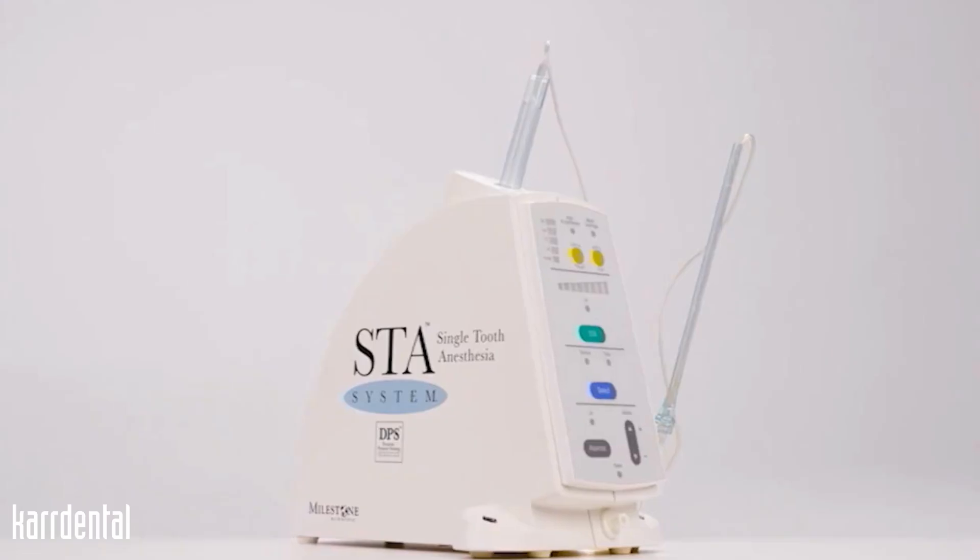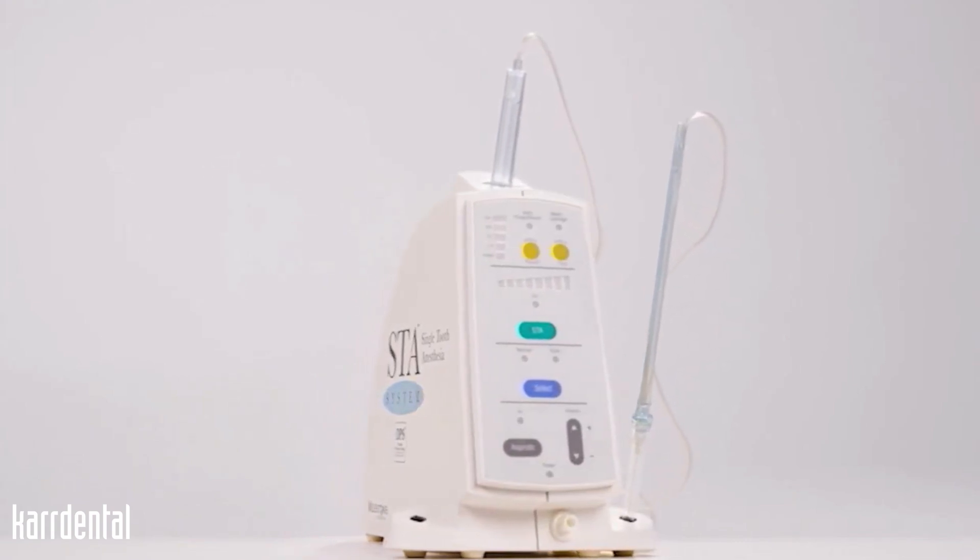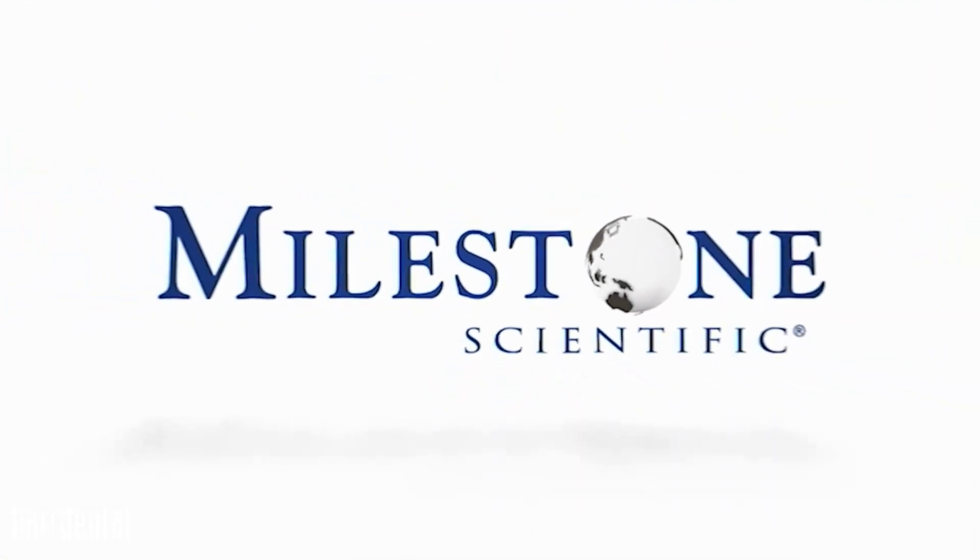On either side you'll see feet, and on the feet is where the needle cap and the handpiece will rest when not in use. Below the volume indicator, you're going to see a connector — that's where your foot pedal will attach itself to the device. For more information on the STA single tooth anesthesia system and clinical studies, please visit MilestoneScientific.com.